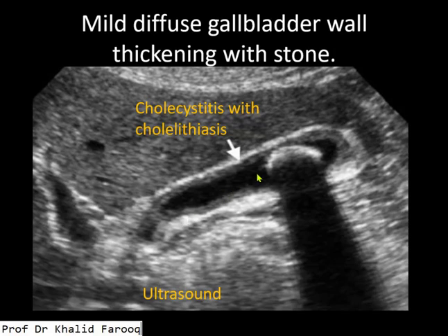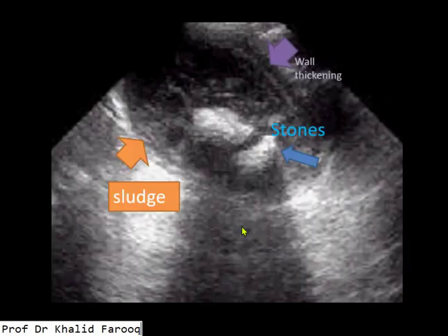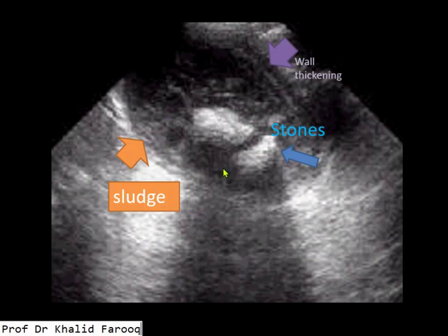This is ultrasound of the upper abdomen. We can see there is a stone in the gallbladder while mild diffuse wall thickening of the gallbladder is noted, suggesting cholelithiasis with cholecystitis. In another example on ultrasound of the upper abdomen, a couple of stones are noted in the gallbladder while there is diffuse wall thickening and we can also see sludge in the gallbladder.